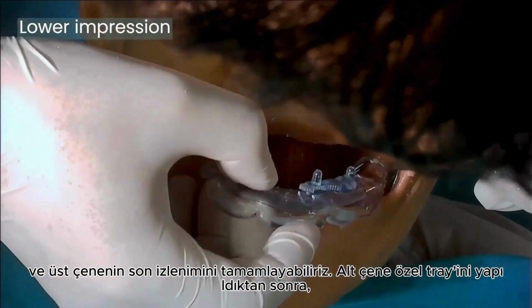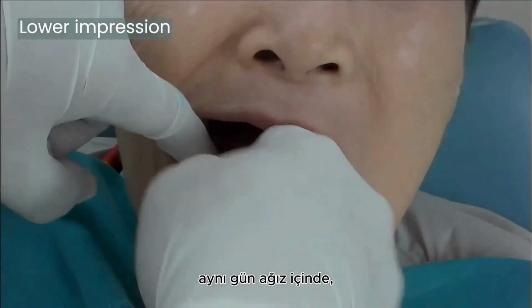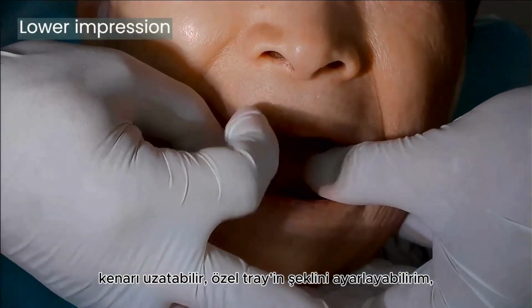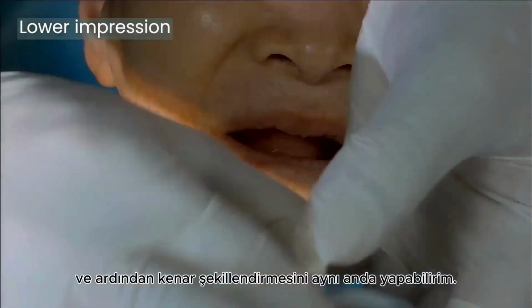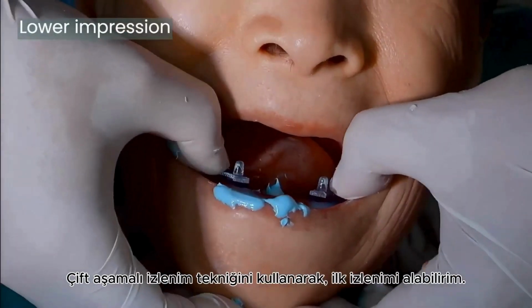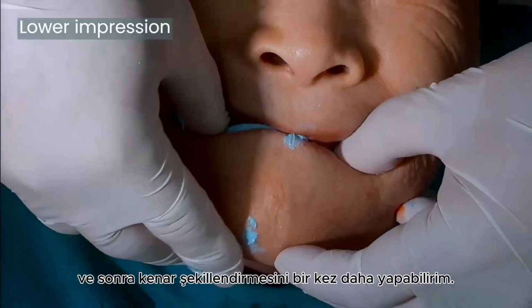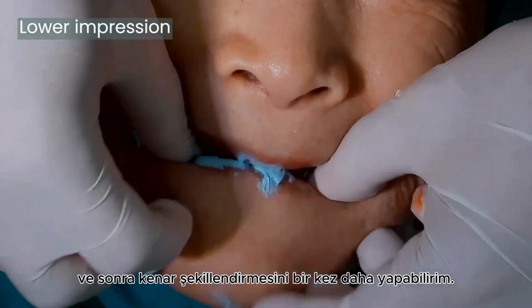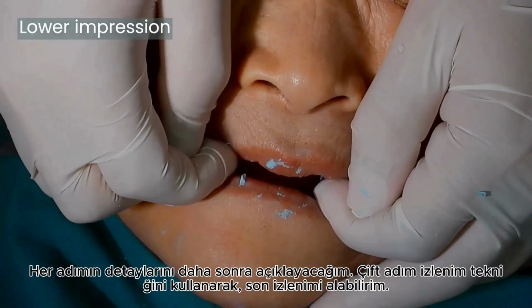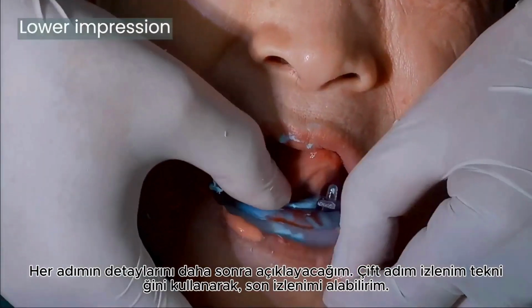After making the lower jaw custom tray on the same day, in the oral cavity I can extend the border and adjust the shape of the custom tray. Then I can do border molding simultaneously. Using the double step impression technique, I take the first impression, and then do border molding one more time. I will explain every step in detail later. Then, using the double step impression technique, I can do a final impression.